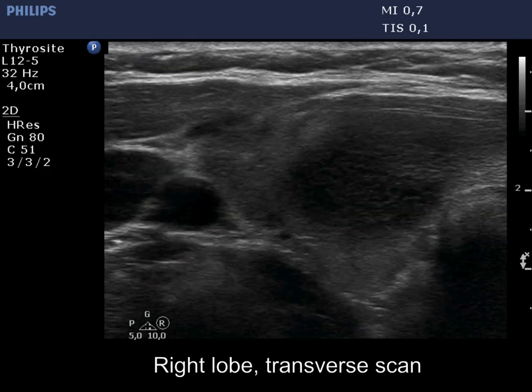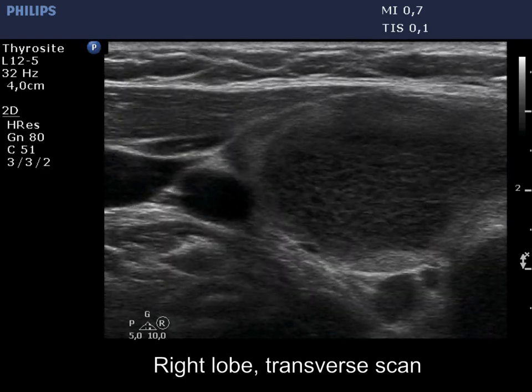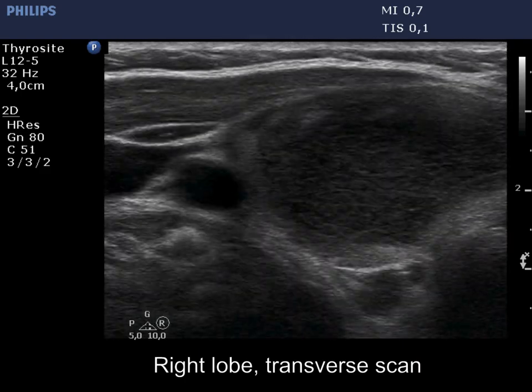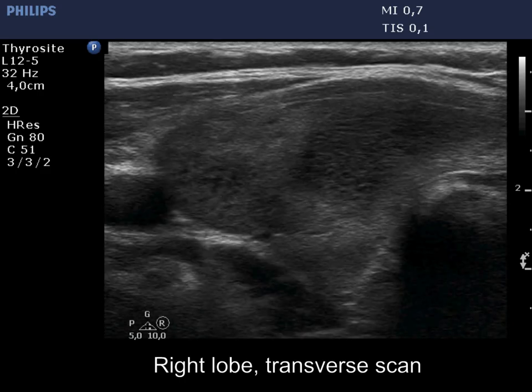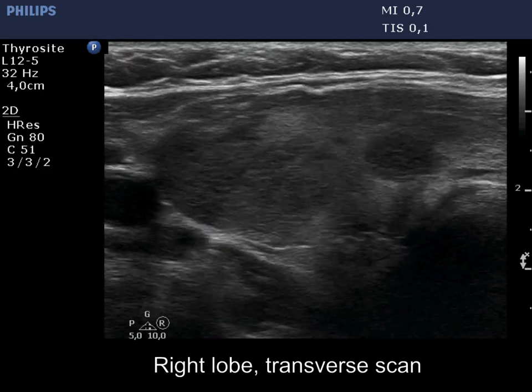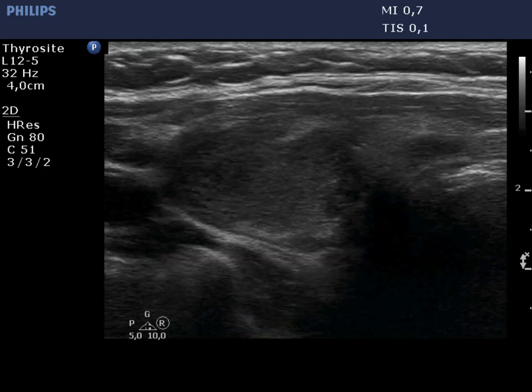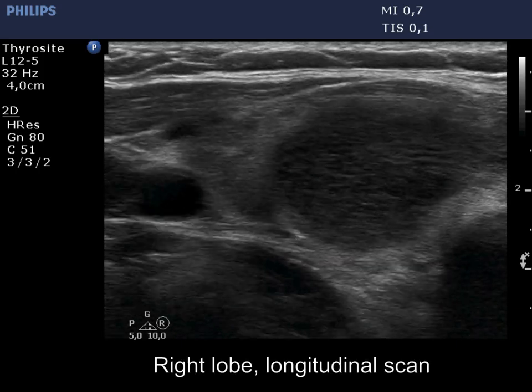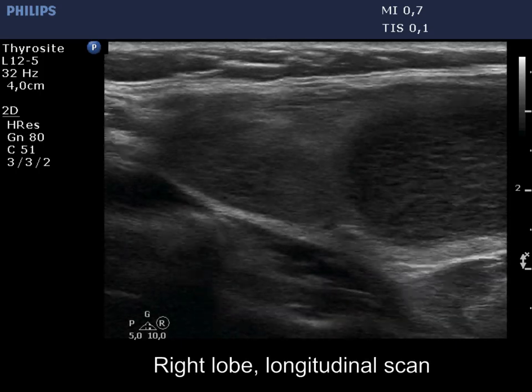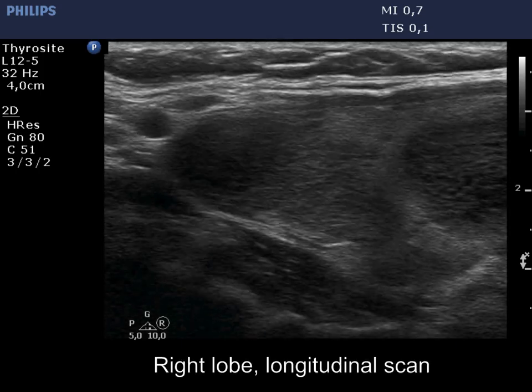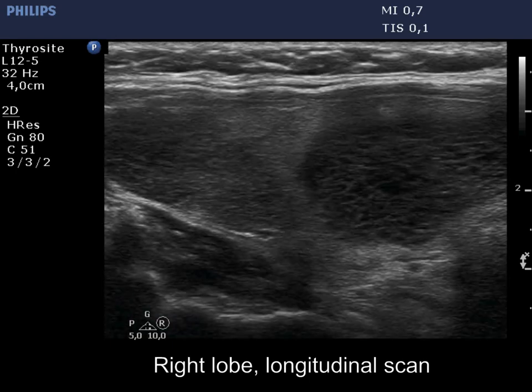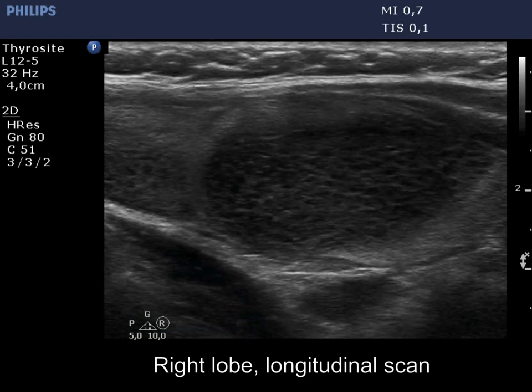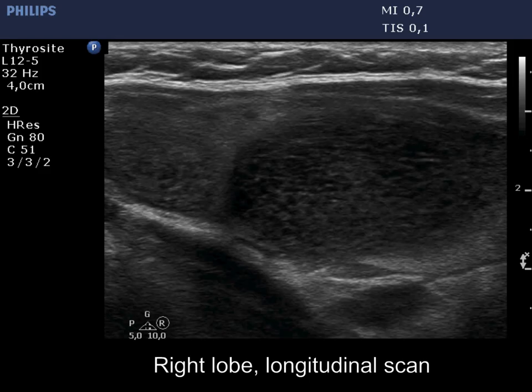The thyroid is ecnormal and in contrast with the previous exam, the right lobe has not one but two relatively large hypoechoic discrete lesions. The lower, more hypoechoic one has developed in the previous three years. Note irregular, lobulated margins and proliferation of connective tissue.